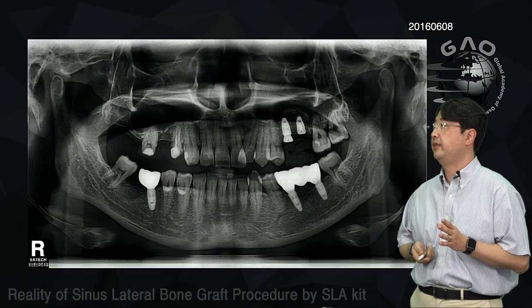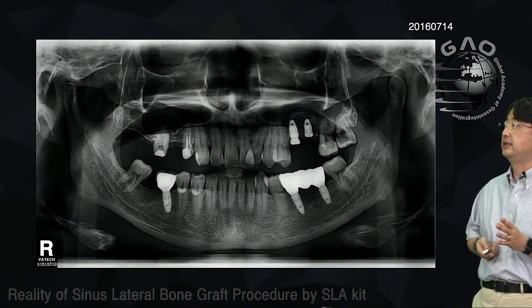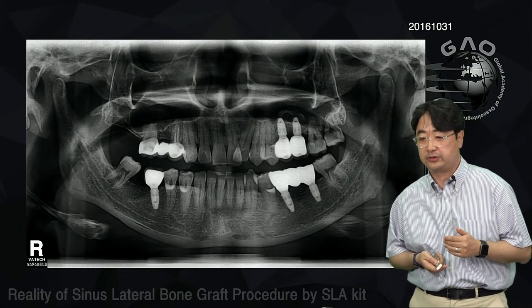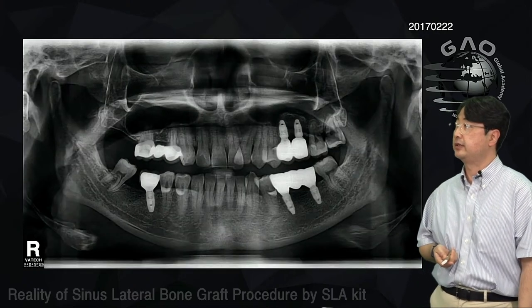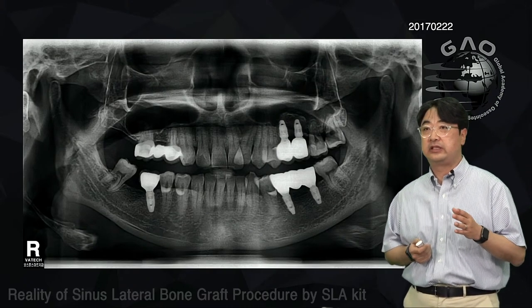Then after 6 months, I placed number 26. This is how it looks. I waited for a while and I finished the restoration for this patient. Okay, so how do you like it? It doesn't look too difficult, right?